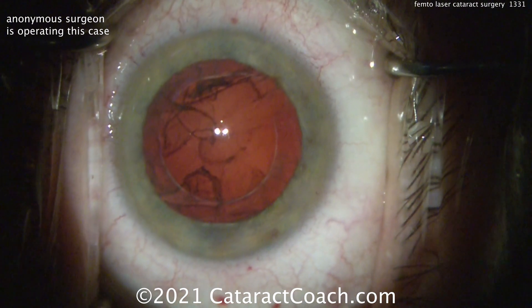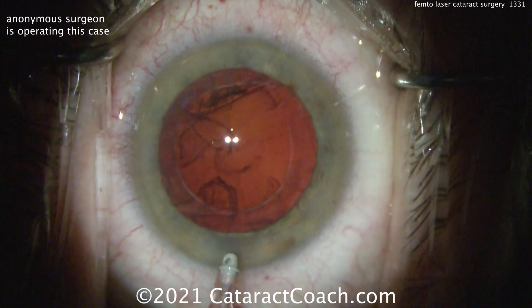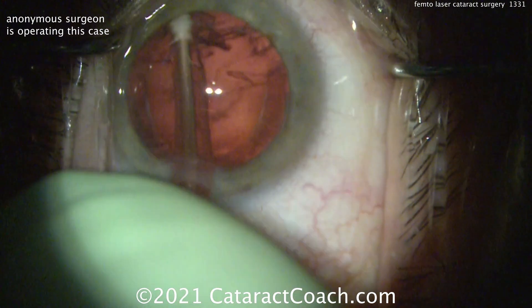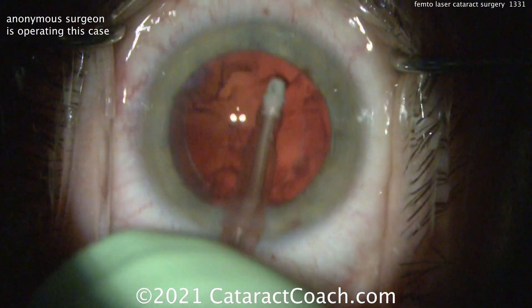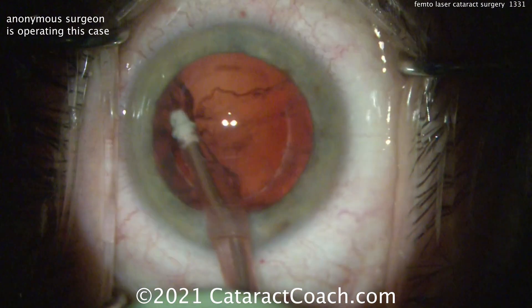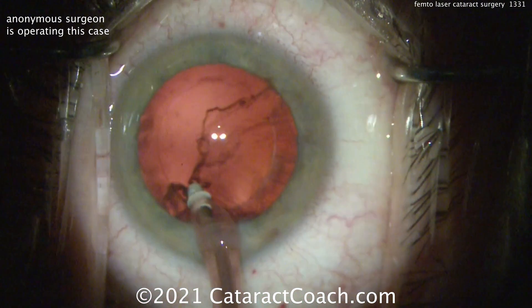And similarly, remember that capsulotomy edge — it's not really a capsulorhexis, it's a capsulotomy. That edge of it is kind of like the edge of a postage stamp — tiny little spots, so small that we can't really see that, but it's not torn like a capsulorhexis. Capsulorhexis — 'rhexis' means to tear — and that means it's a lot stronger.